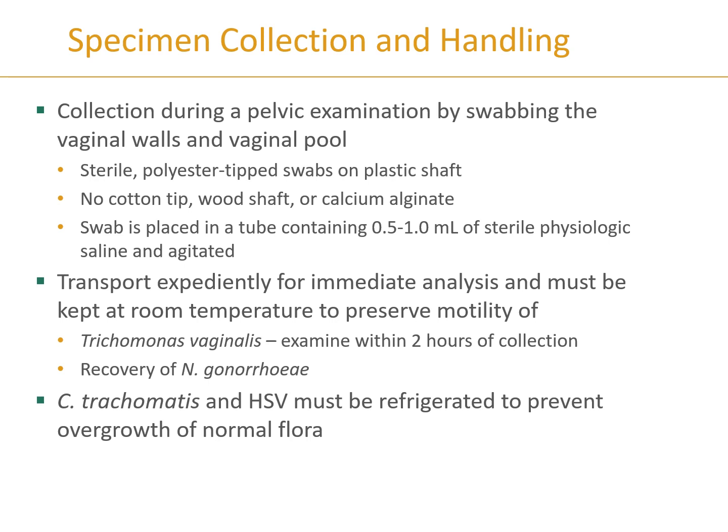If someone comes to the lab looking for a swab, you want to make sure you know what test they're doing, because the swabs are not interchangeable from kit to kit. For example, doing a wet mount would need a specific swab, so they would need the wet mount containers for that. It would go into some sort of transport container and be taken immediately to the lab so that it can be examined pretty promptly.